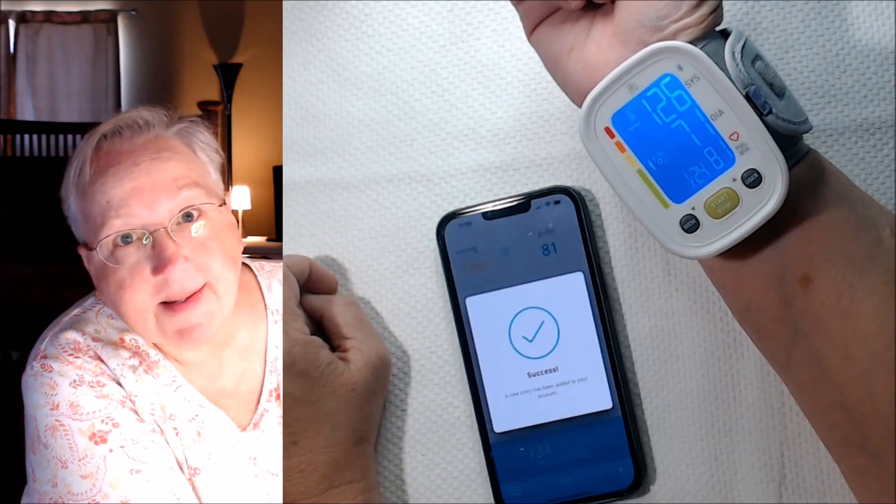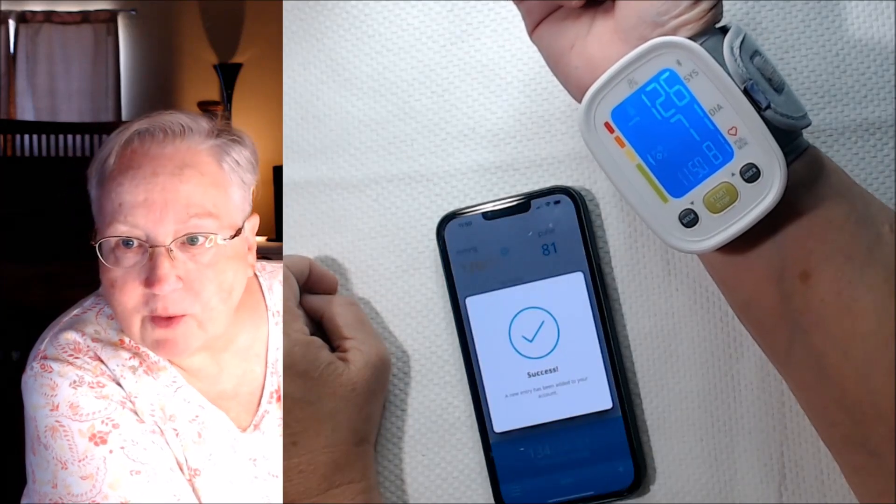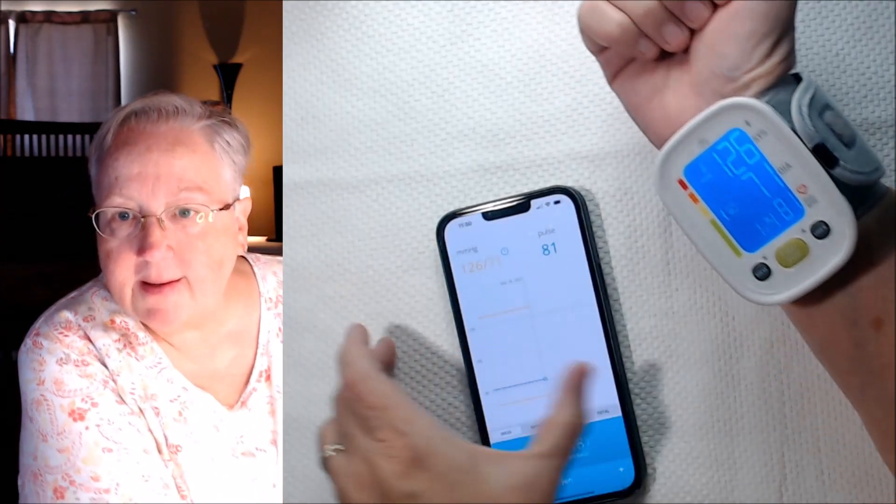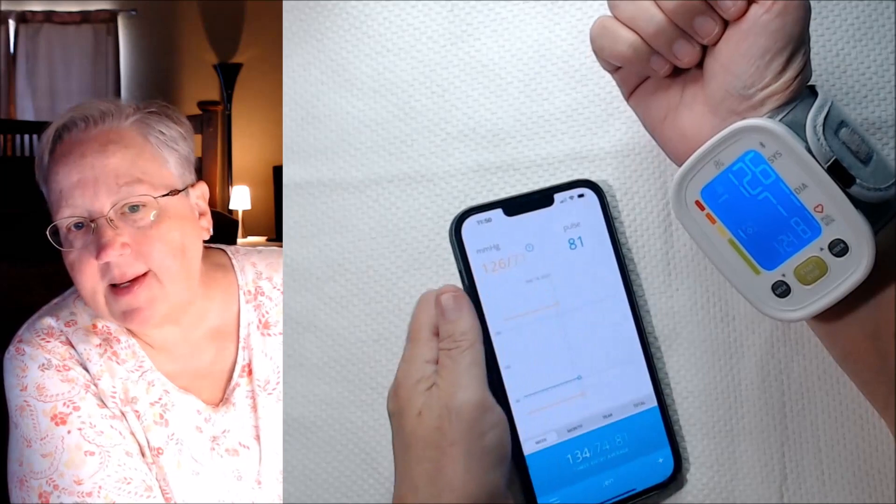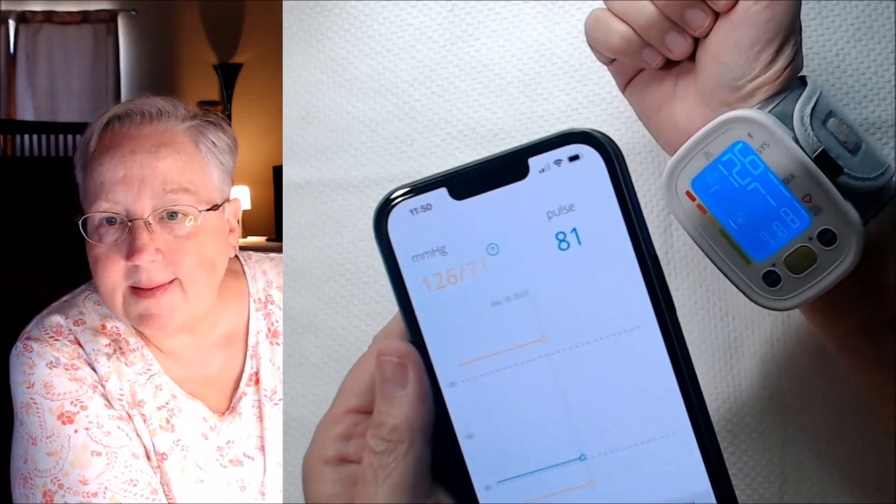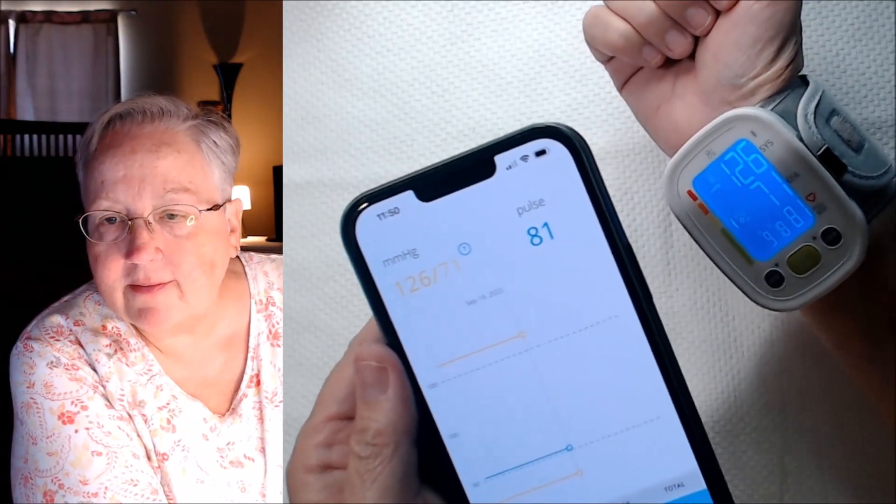126 over 71. There it says success. And there you can see 126 over 71.